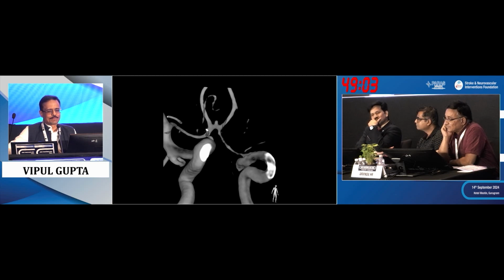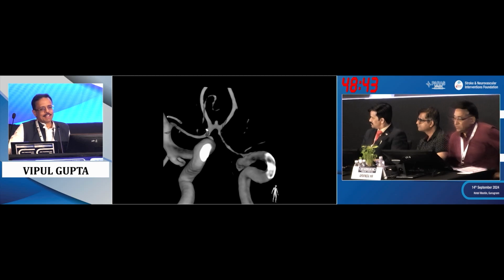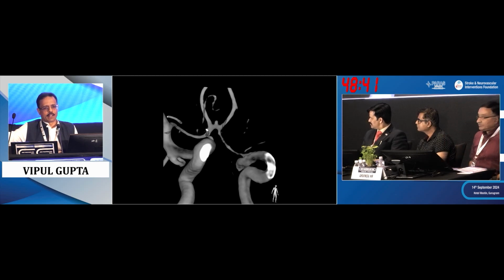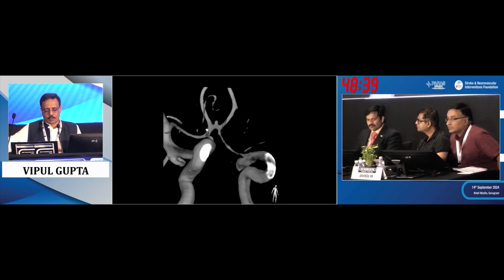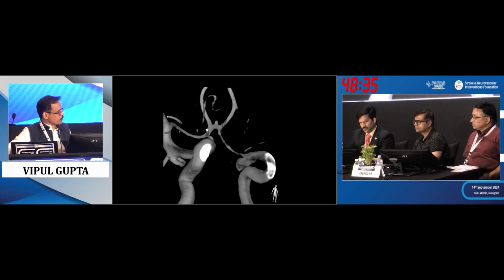I think the problem, yes, in SLICE it was different. The case was a little bit different. But the problem we know if we post a flow diverter A1 to A2 is that you have a contralateral A1, A2 and it's exactly in the middle. So you may expect the flow still going into the aneurysm. Yes, so it's not exactly the same case. You're right, that had a much wider ACOM, and here, with the left A1, the jet of blood will go into this ACOM aneurysm.